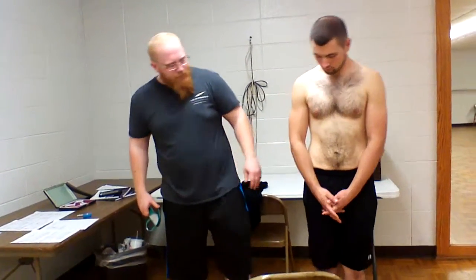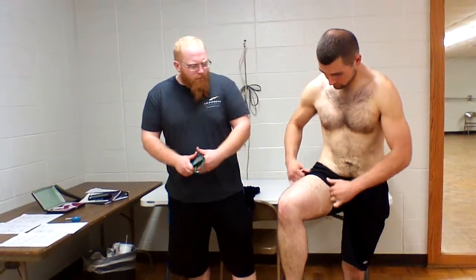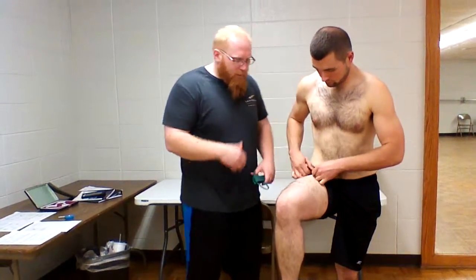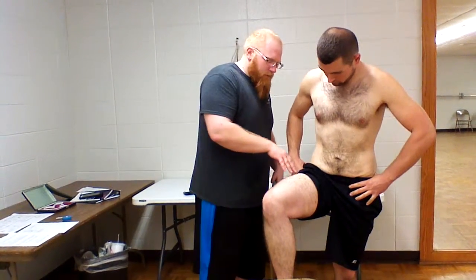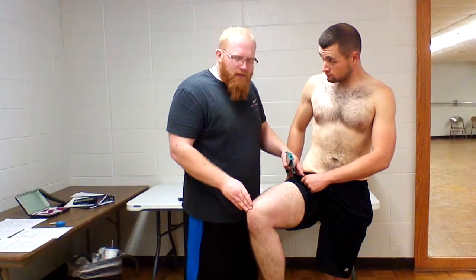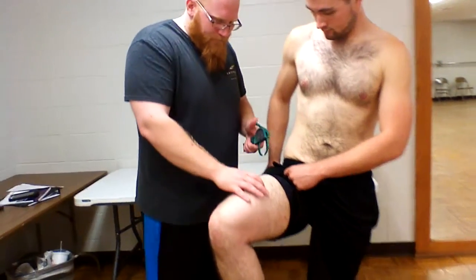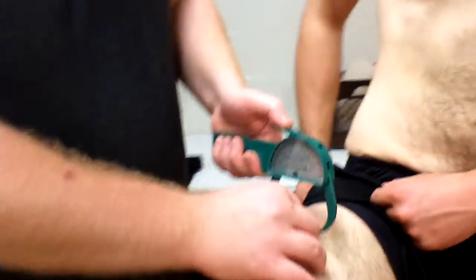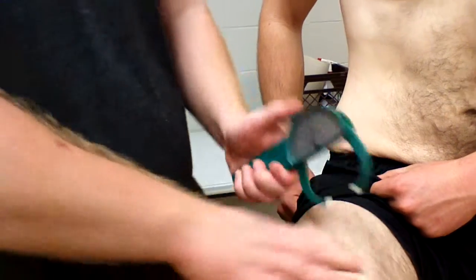So next we're going to do the thigh. Go ahead and put your foot up there. For the thigh, it's going to be in the anterior midline, right in between the top of the patella and the inguinal crease. So about halfway. 18.